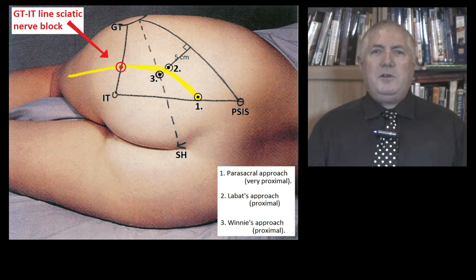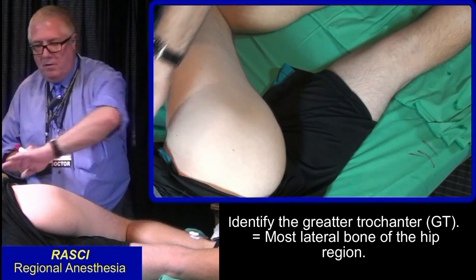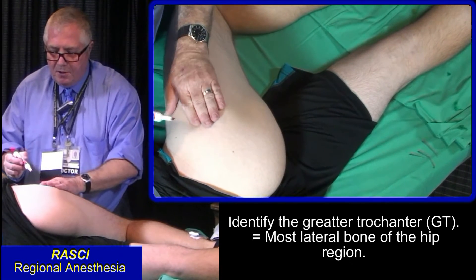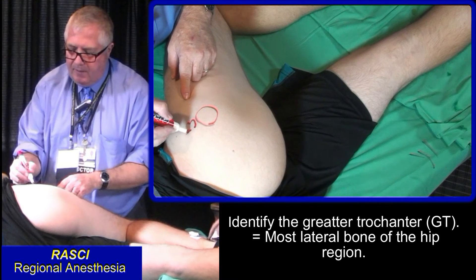First, flex the hip joint with the patient in the lateral position and the block side upward. Let me show you the landmarks. The most lateral bone you can find in the body is the greater trochanter — it's like a big round bulge. Call it GT.